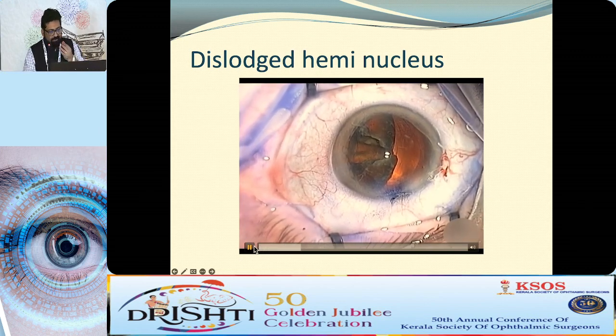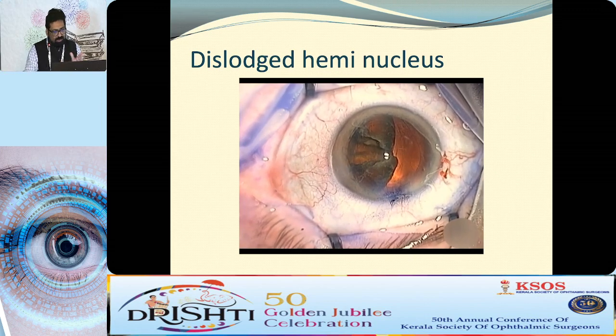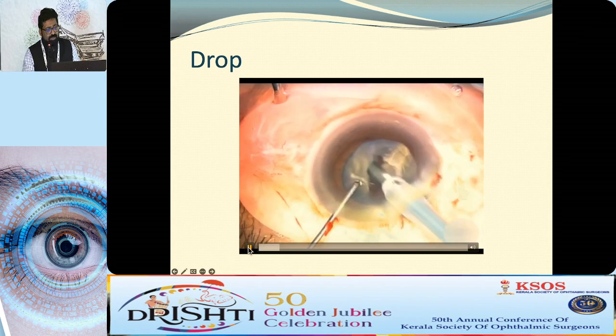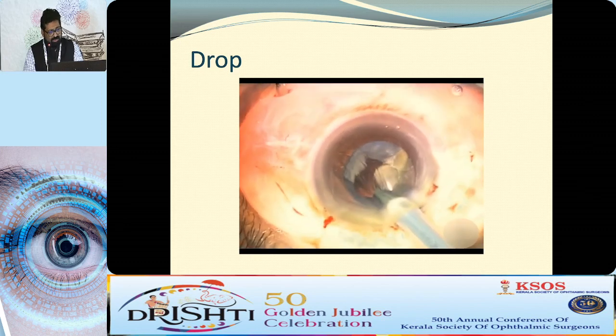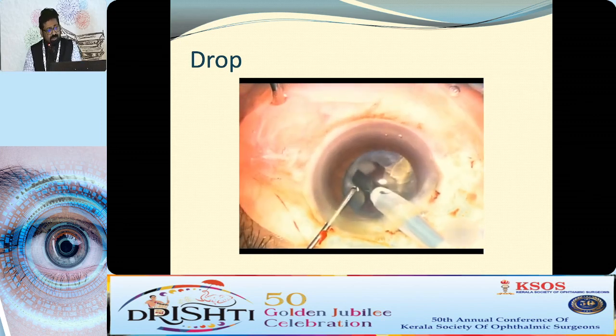See, half the nucleus is removed. You can see it is tilting, slightly tilting. So it is the clear area is seen on the right side, and this is a major indication that you are in a soup. Okay, then obviously this is the nucleus drop. You know, he is trying to pull a peripheral, and this thing is already dropped. So again, instead of pulling out, you should put viscoelastic, plug, and then go ahead.